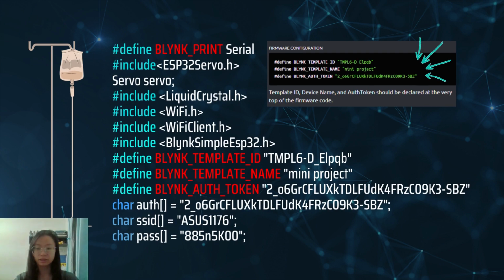The define directive is used to define a symbolic constant BLYNK_PRINT which is set to Serial, whereas include directive is used to include the necessary libraries for the project. Next, the IoT platform that we use is Blynk. The Blynk template ID, template name, and authentication token are defined to configure the Blynk template. Finally, the characters or char are declared to store the Wi-Fi network credential.